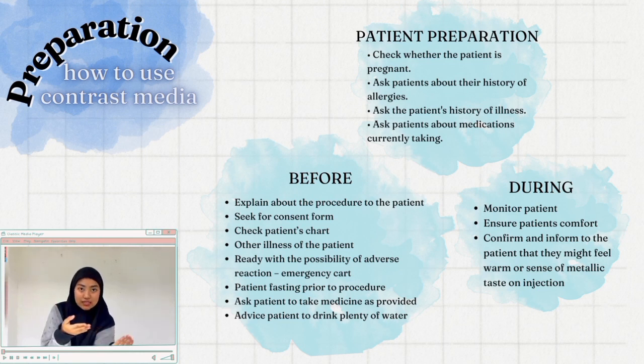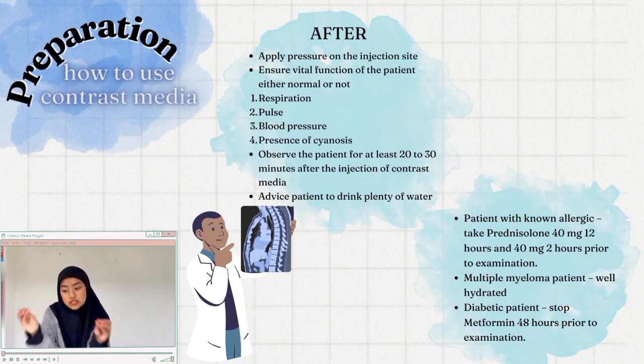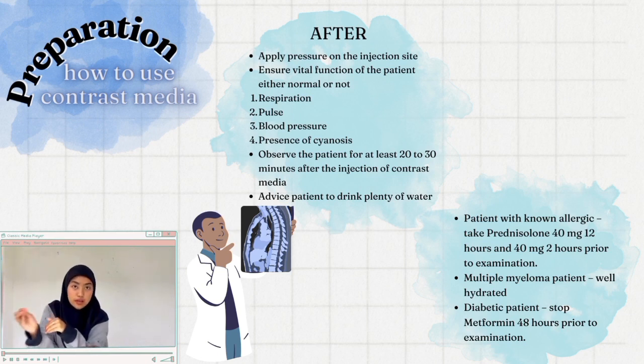on injection. Lastly, after the procedure of contrast media, we need to apply pressure on the injection site to stop bleeding. And then we must ensure vital function of the patient such as respiration, blood pressure, presence of cyanosis. Cyanosis is the medical term used when skin, lips, and nails turn blue due to lack of oxygen in blood.